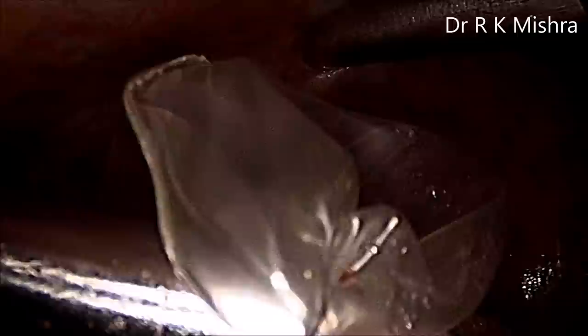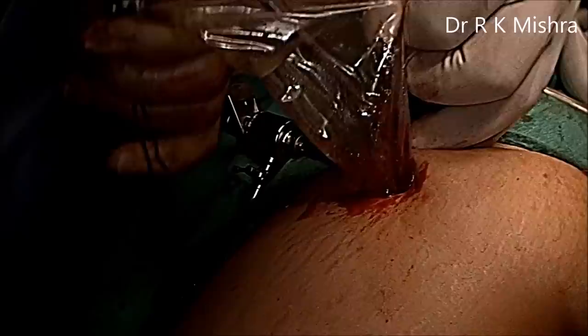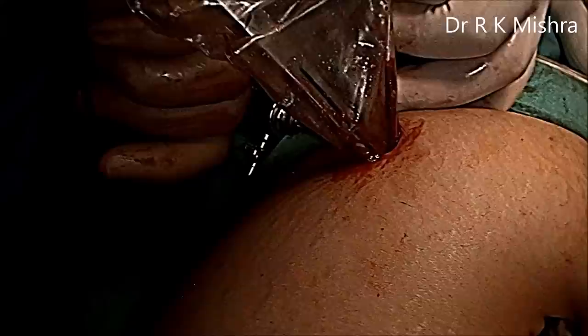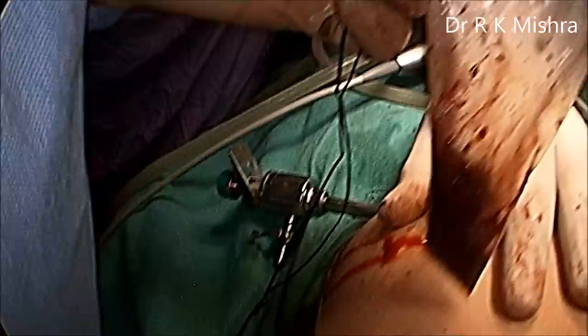The mouth of the endo bag is brought out through the 10 mm cannula. The outside assistant keeps it open, and with ovum forceps you can crush the trophoblast and deliver the tube and trophoblast out carefully. Once it is crushed, the endo bag is automatically taken out. Here inside the endo bag we can see the ectopic, which is completely taken out. The endo bag is nicely intact — not ruptured.